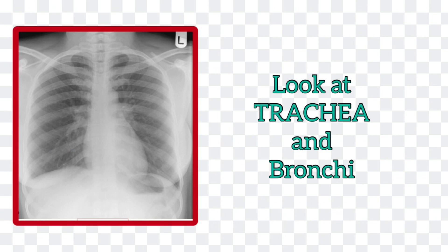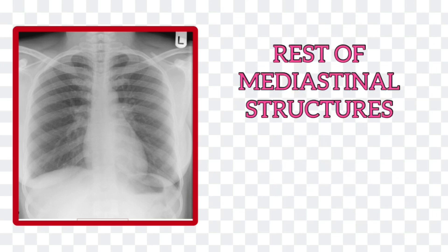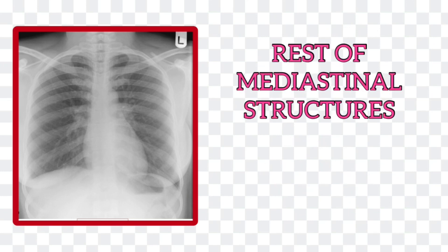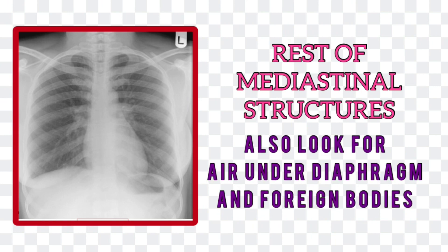Now look at the trachea — it should be central, but slight deviation towards the right around the aortic knuckle is normal. Look at the rest of the mediastinum. Apart from the heart and trachea, the mediastinum contains the great vessels, esophagus, nerves, thymus, and lymph nodes.